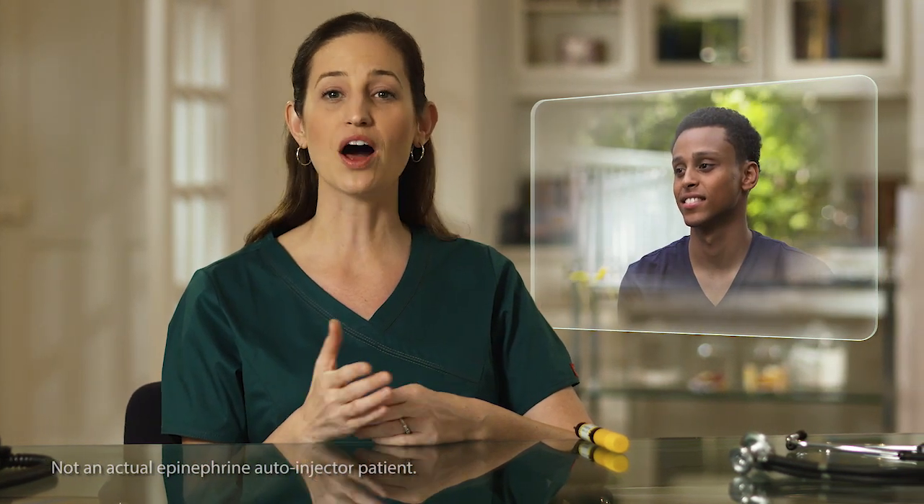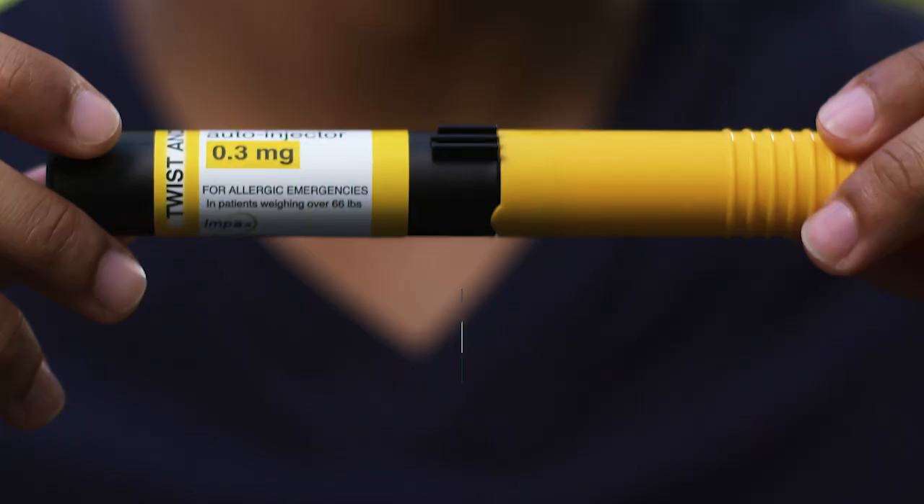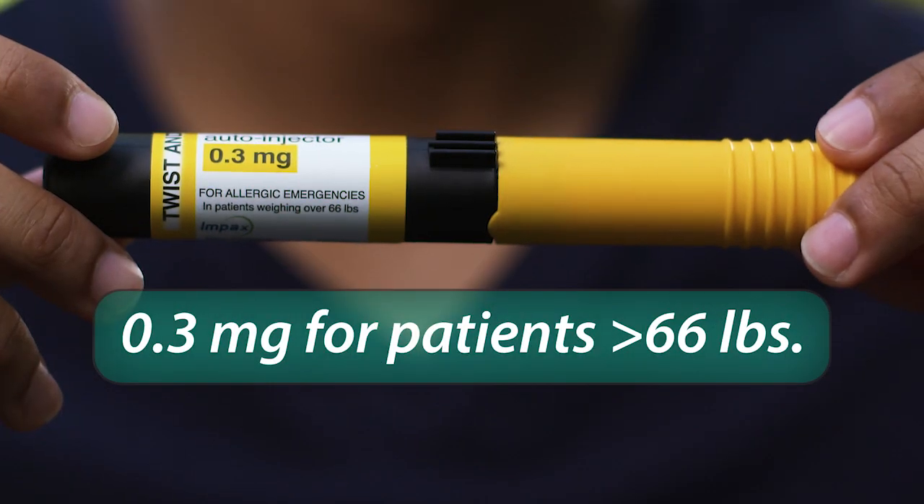Adults like Mark will be prescribed the auto-injector with the yellow label. This auto-injector contains the proper dose of epinephrine for people weighing more than 66 pounds. That's what I got right here.